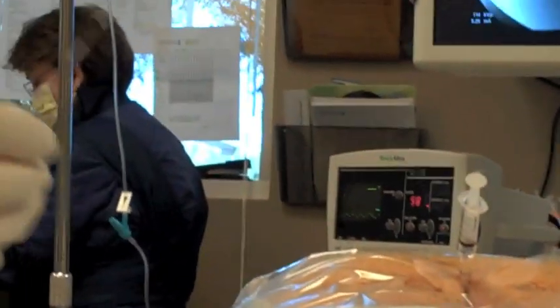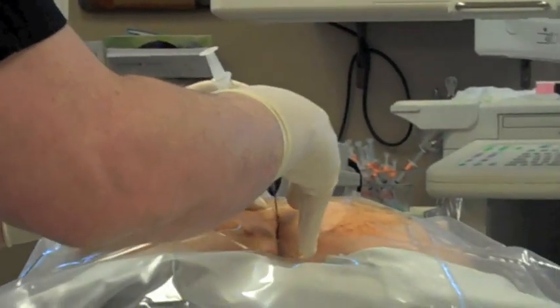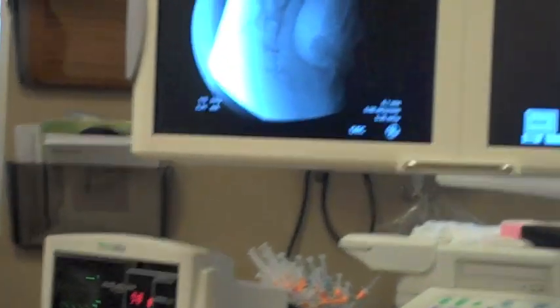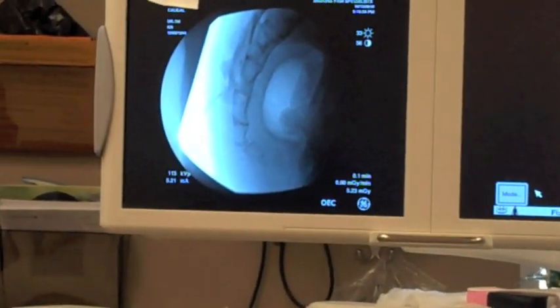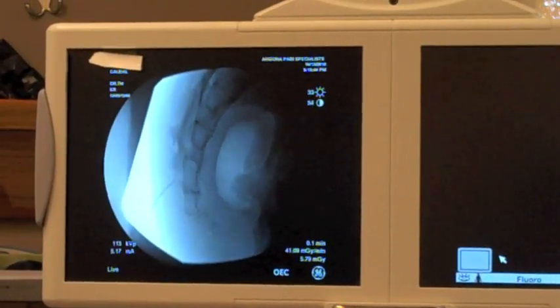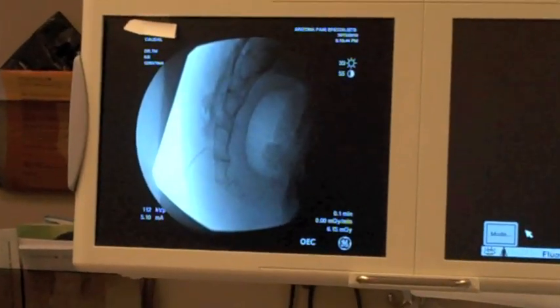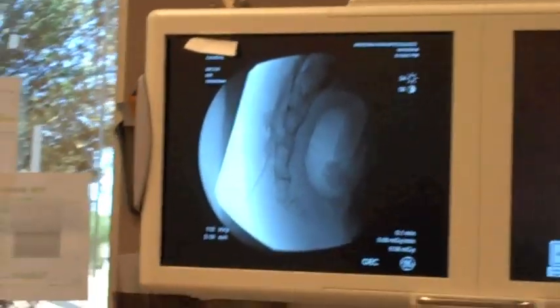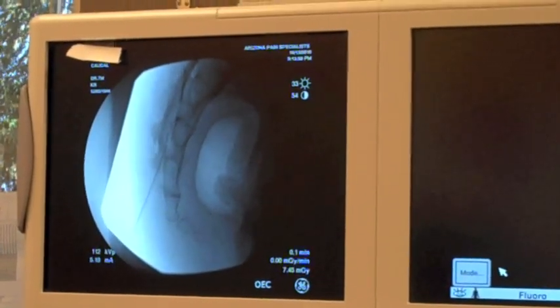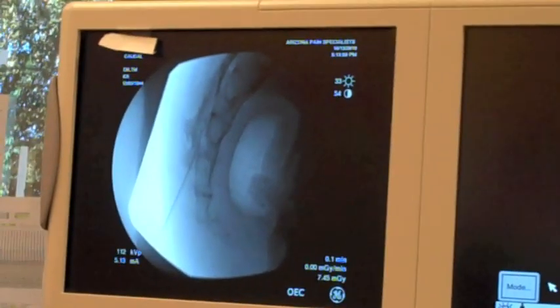And then we're going to advance the epi-med needle into the sacral hiatus — that's the sacral part of the epidural space. Through that needle, we're going to place our catheter.